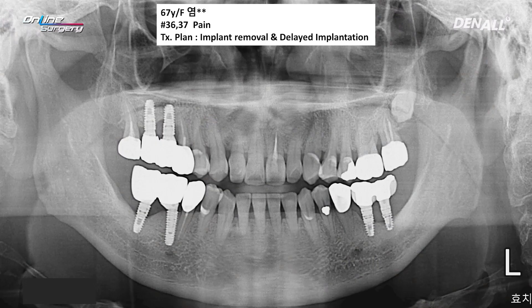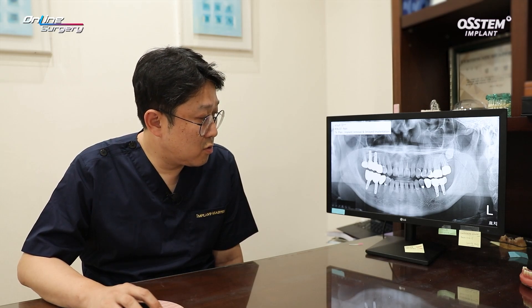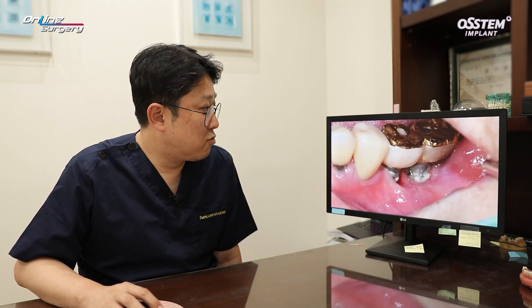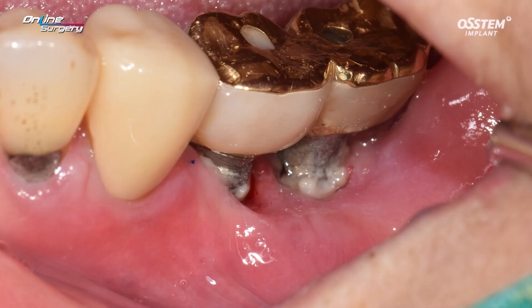The plan was to remove the implants and place two new implants. However, the inferior alveolar nerve was very close, so it would not be right to place another implant immediately after removing the existing one. The plan was to remove the implant, rebuild the alveolar bone using GBR, and perform delayed implant placement. If necessary, more GBR would be performed at the time of placement.